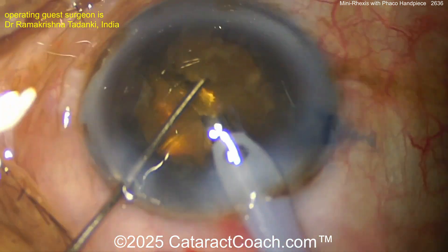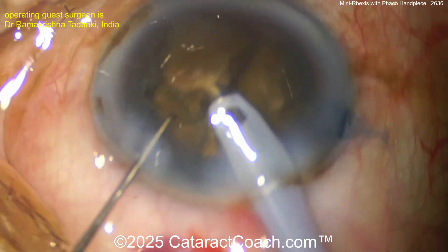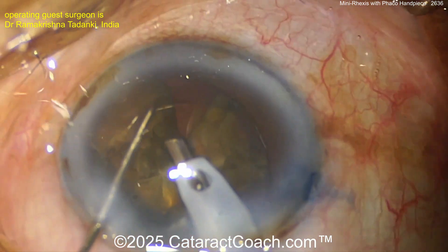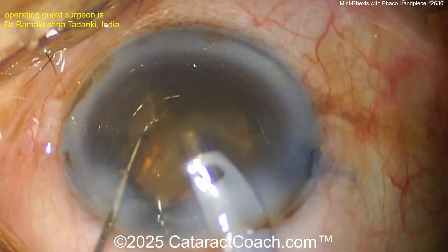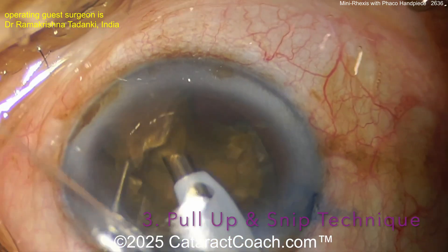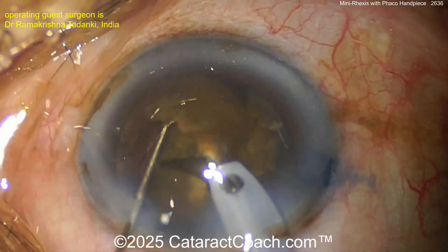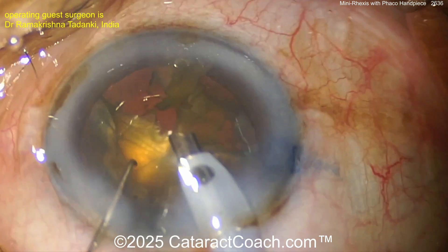Now that you've had all those chops, getting the base of the first piece up — and once you get that first piece up, the rest should come out a lot easier. You may still be a little attached at the bottom, and that's okay; just debulk as much as you can, creating room. Then go right down to the base and apply vacuum to break that adherent posterior plate.